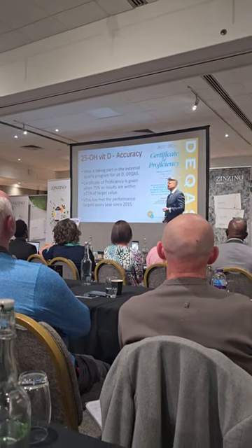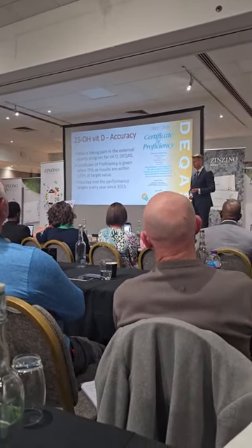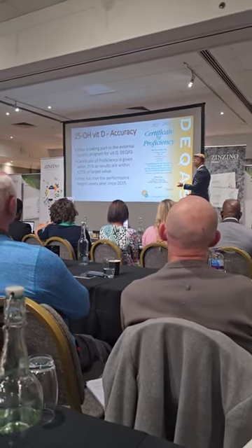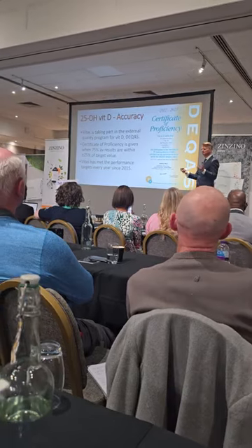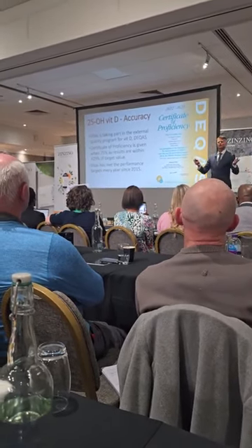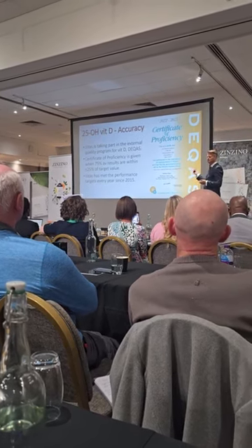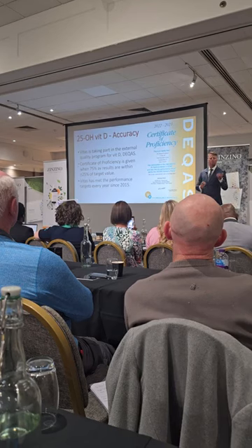We also participate in something called quality assurance programs, round robin test. This is actually a UK university in London that makes 1,000 identical samples like we do for the control samples. They send it to all the labs in the world, and there are more than 1,000 labs participating in this program. The labs use their method, their people, their machines to produce a result.